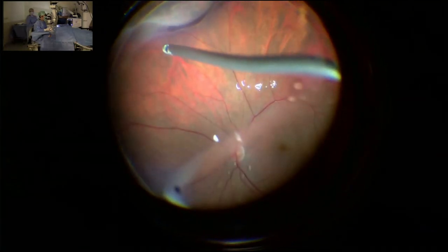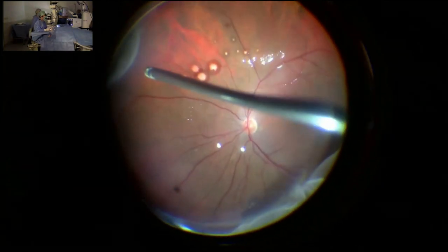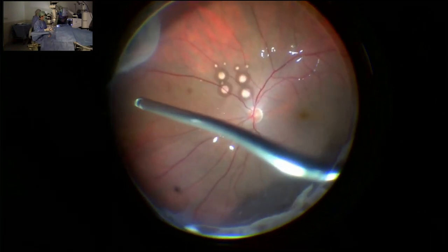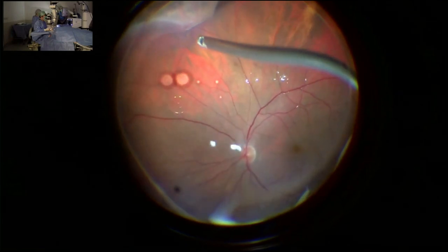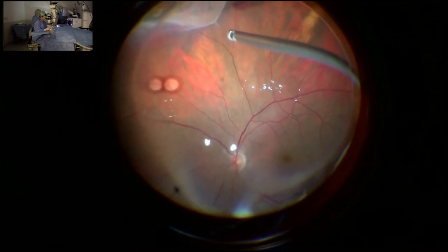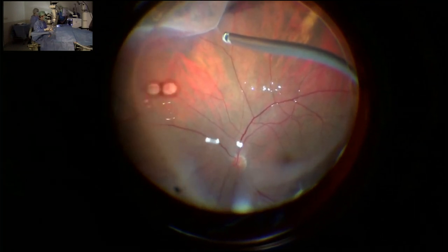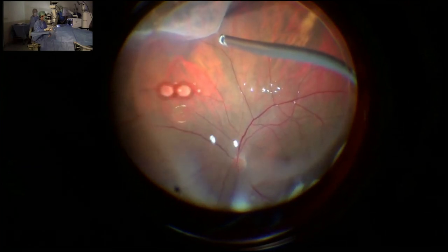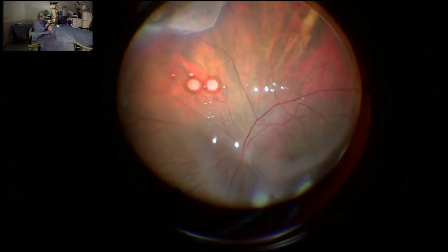So there is no retinal detachment in this area, but I will show you now. There's a small retinal tear just over here. Maybe you can see. Yes, that white area is a small retinal tear. I will make a mark there with diathermy to do laser later on. Could you please give me diathermy?